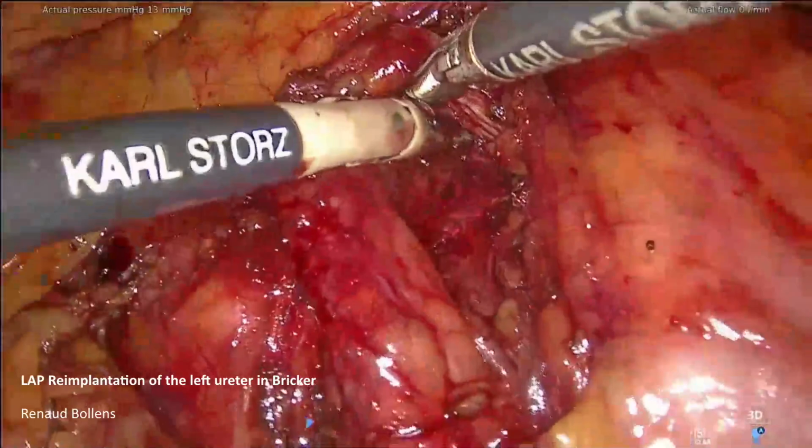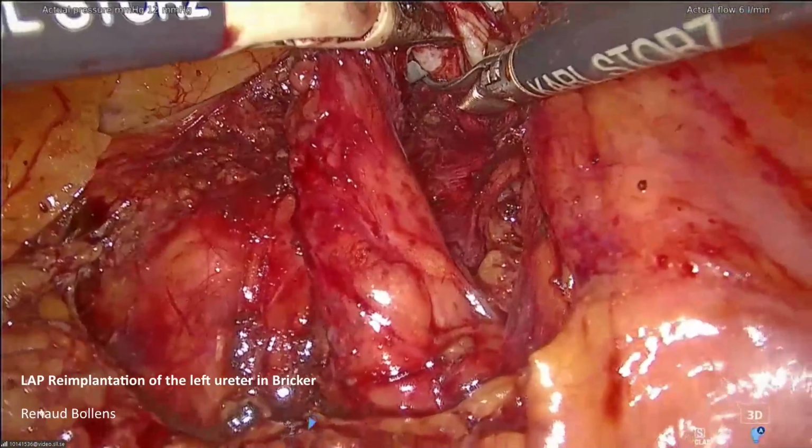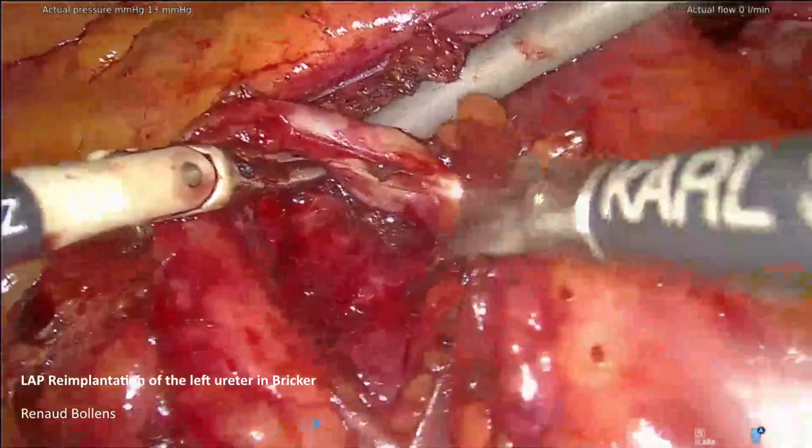If you see at the beginning, after the surgery, the first day, that you have a lot of urine leak, you have to put a bladder catheter at the end of the bowel segment. But in this case, the segment is so long, it will be in all cases a mess to pass something all along it. We will probably need to do a flexible cystoscopy to be sure.